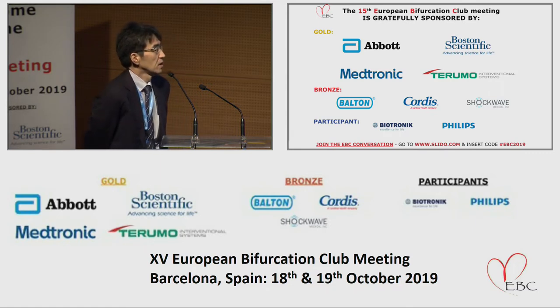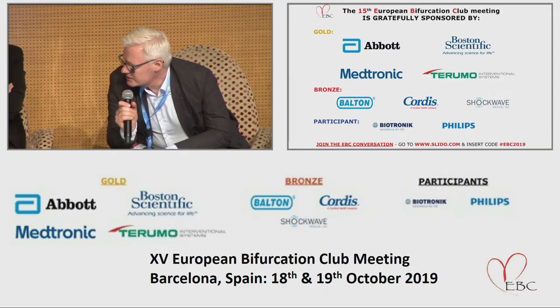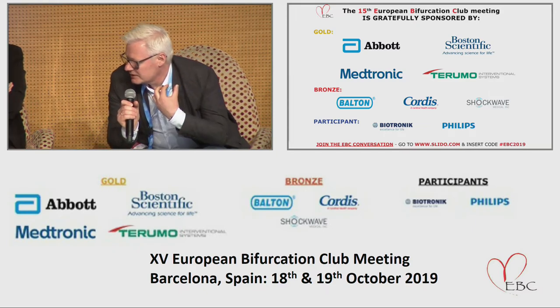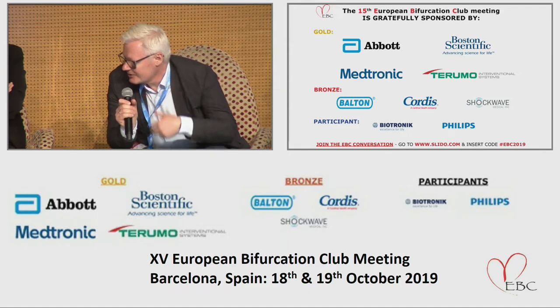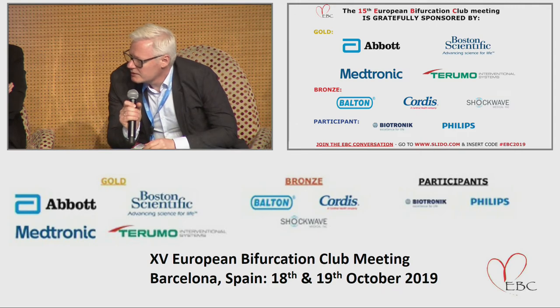Any more questions? Last year we discussed with Patrick this problem of fusion imaging, especially for left main. It would be very helpful, I believe. Because if you go out with the guiding catheter, contrast injection is not effective, and even in your pictures the image quality for the assessment of the ostial or proximal left main was poor.